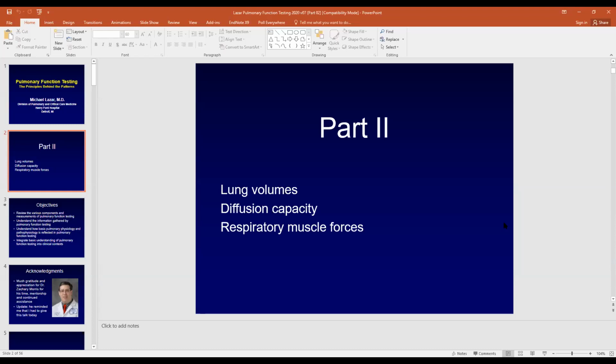I suspect that part of pulmonary fellowship and pulmonary training is you should understand what normal values mean and where we get abnormality from. But there are already 1,000 numbers, or 100 numbers, on the test sheet. Putting more numbers on there is probably going to create more confusion than putting fewer numbers on there.